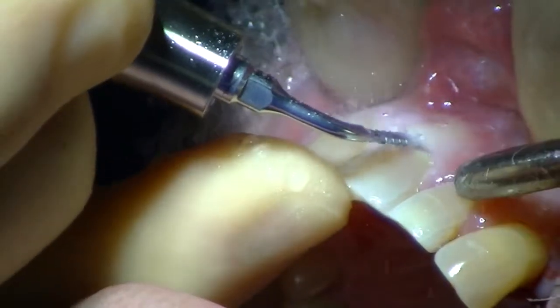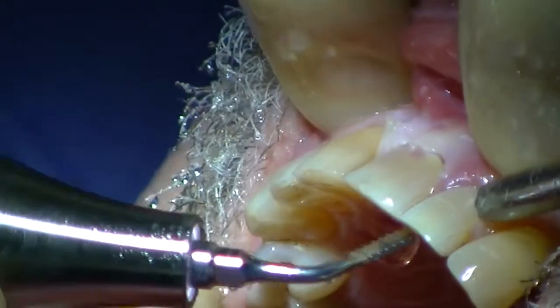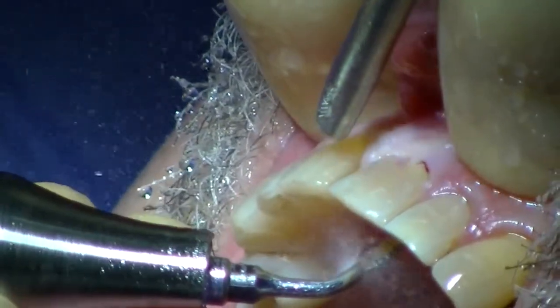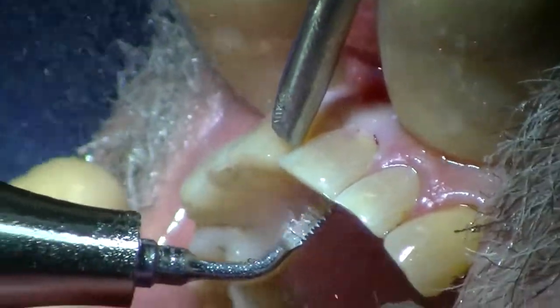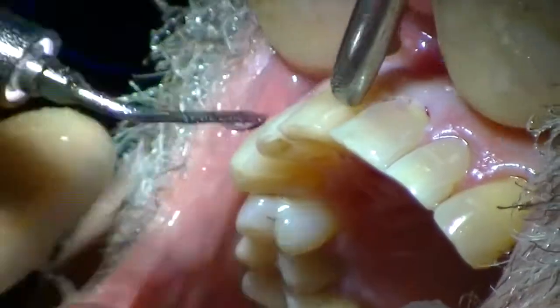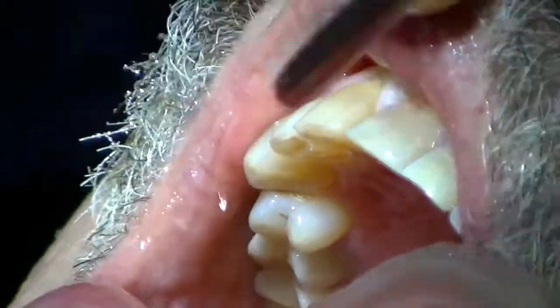Trying to maintain the facial plate of bone if possible. So rather than using a conventional periotome, we're able to see if we can move the tooth.